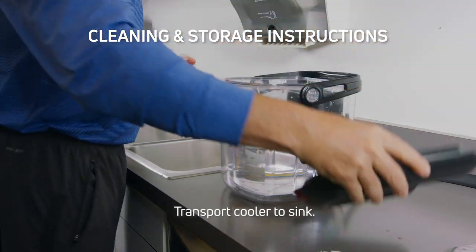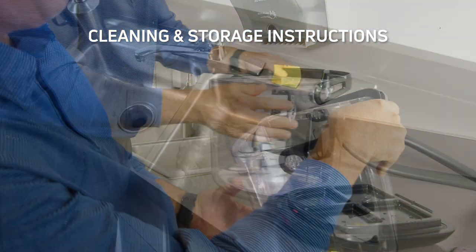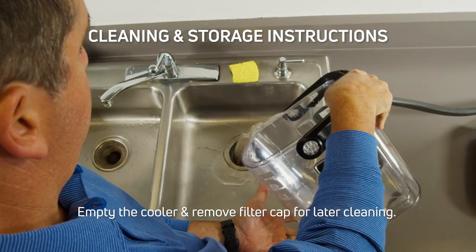Transport the cooler to the sink. Empty the cooler and remove the filter cap for later cleaning.